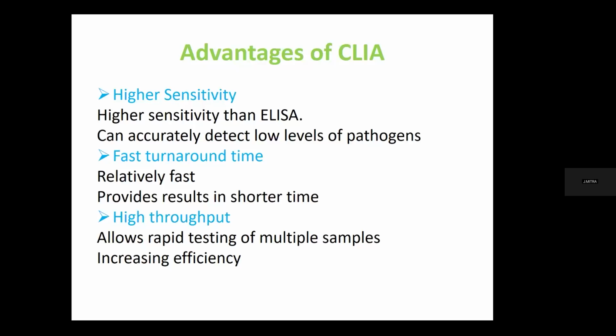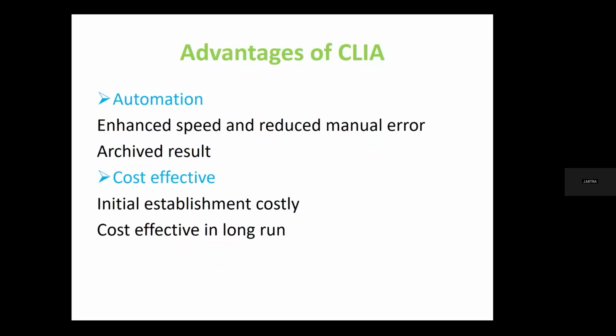And high throughput, it allows rapid testing of multiple samples, which of course increases the efficiency of the testing protocol. And as it is a fully automated machine, it reduces the errors associated with manual handling. Also we can archive the results, and whenever we want to see any past result, we can retrieve it from the machine. And it is also cost effective, because although there is an initial establishment cost, once it is running smoothly it is cost effective in the long run.